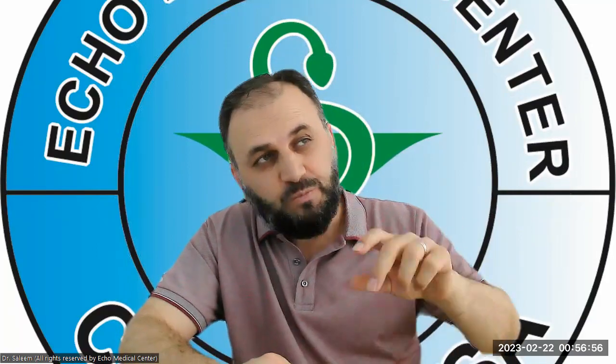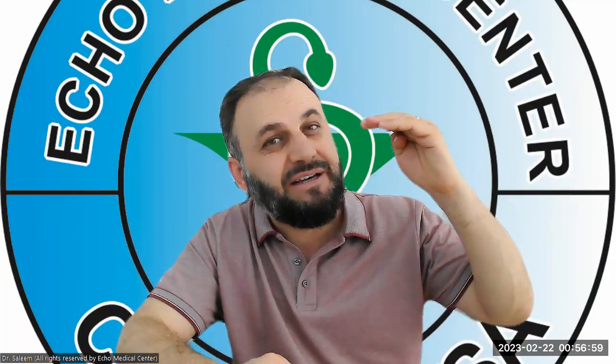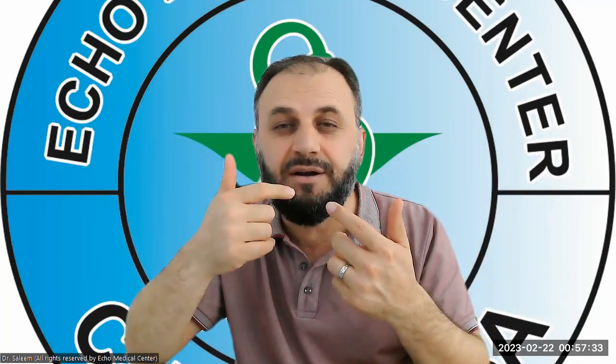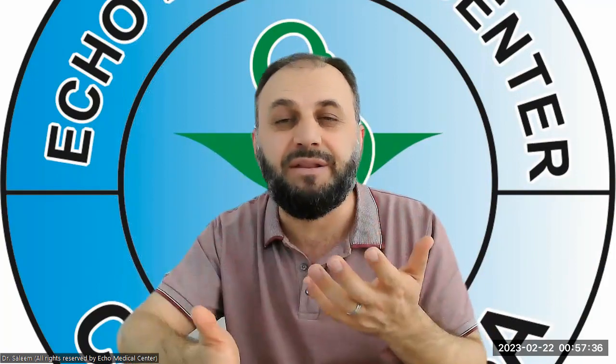Now, after the bulbous, we take the ECA sagittally. It's not important which one you take first, but I strongly suggest taking the ECA first, in gray color and pulse wave Doppler. Try your best. If it's a normal study for the ECA, external carotid artery, try your best to find that high resistant flow, because we all know those 8 branches are feeding the maxilla area, the muscles of the face, thyroid tissue, the ear and the temporal area, the tongue. So all these areas are fed by the ECA.